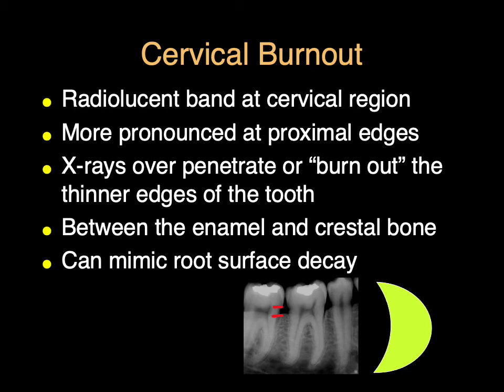One way to differentiate root surface decay from cervical burnout is that burnout does not extend underneath the enamel and stops at the crestal bone — it's a radiolucent area between the enamel and the crestal bone. On this radiograph, there's burnout in multiple places. If the contacts are more open towards the crestal bone, we can get an explorer in; if we feel a cavitation, it might be root surface decay. But often we can't get our explorer in there and have to rely on our radiographic exam to decide if intervention is necessary.